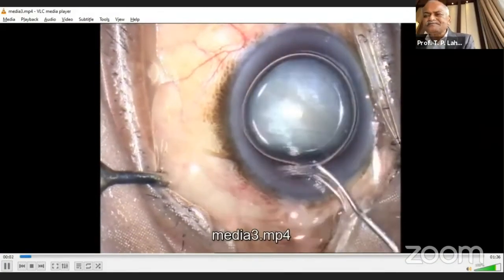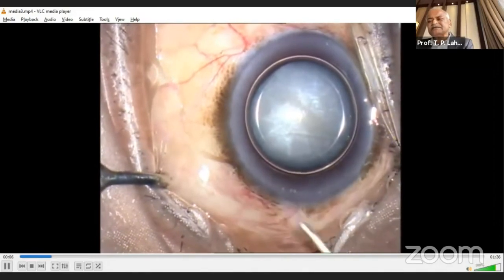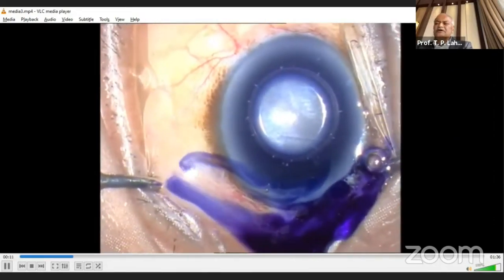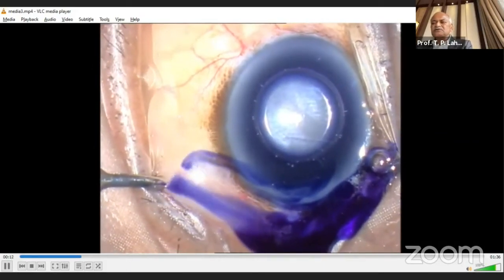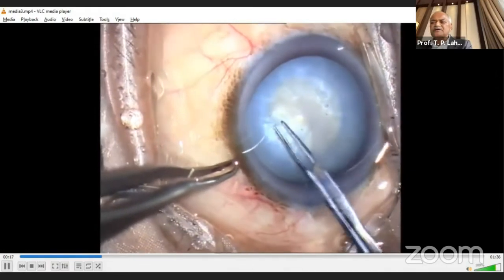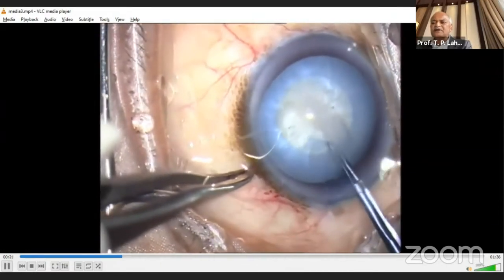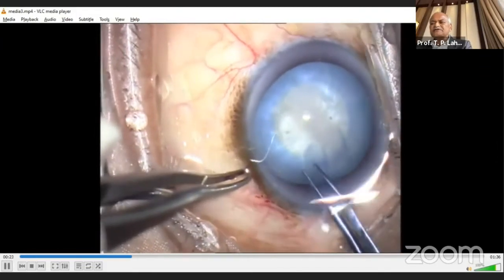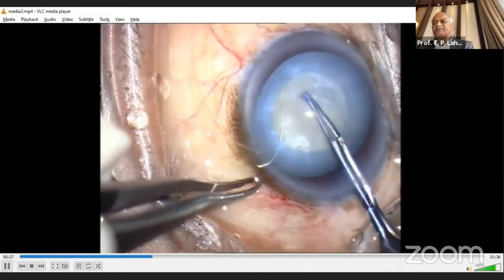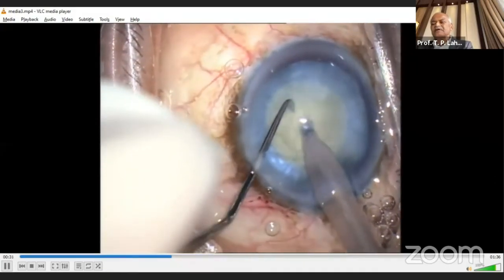Now, this is another case. You can see here, I'm just staining this case. And after the stain, I will do the rexis. So whenever you are doing such type of white cataract, I use the forceps, because of the anterior capsular calcification or fibrosis, it goes on one side by the needle. So better to go with the forceps. Again you will see this, I have completed.